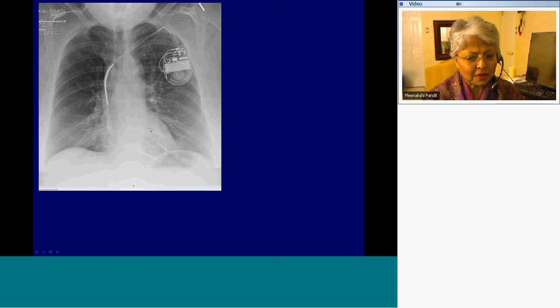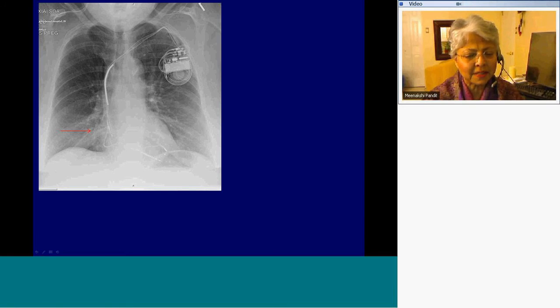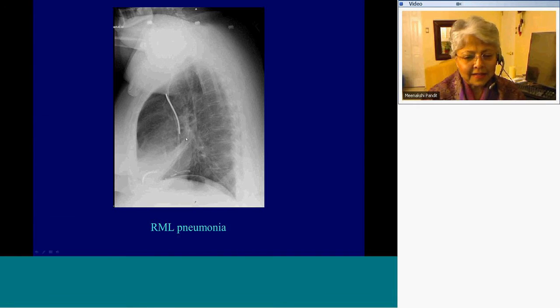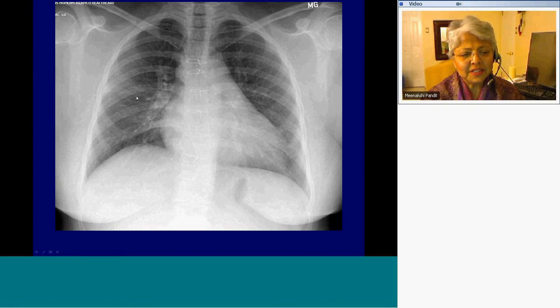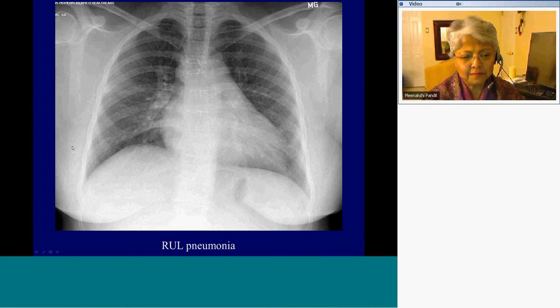Here it's not so subtle — the right heart border is clearly silhouetted, so we know that there's something wrong in the right middle lobe, and that's confirmed by the lateral view. And here is a variable increased density above the minor fissure caused by a right upper lobe pneumonia.